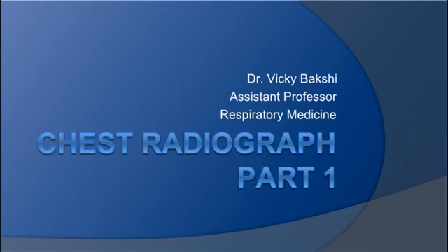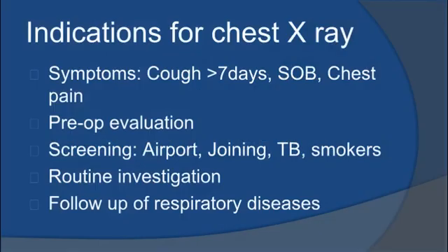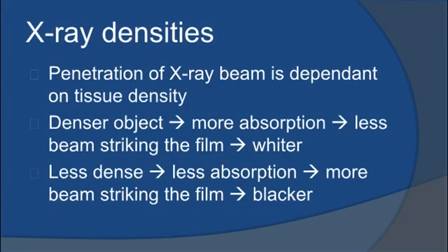Today we will be learning about chest X-rays. Chest X-rays are indicated for symptom evaluation, pre-operative checkup, screening for diseases, fitness certificates and follow-up of respiratory and some cardiac diseases. Penetration of X-ray beam is dependent on tissue density.